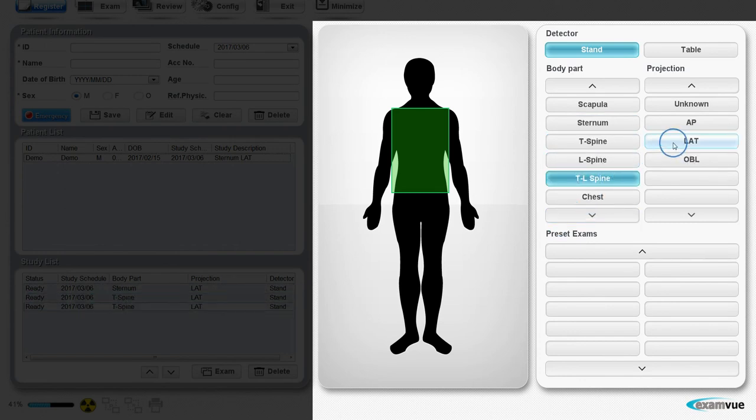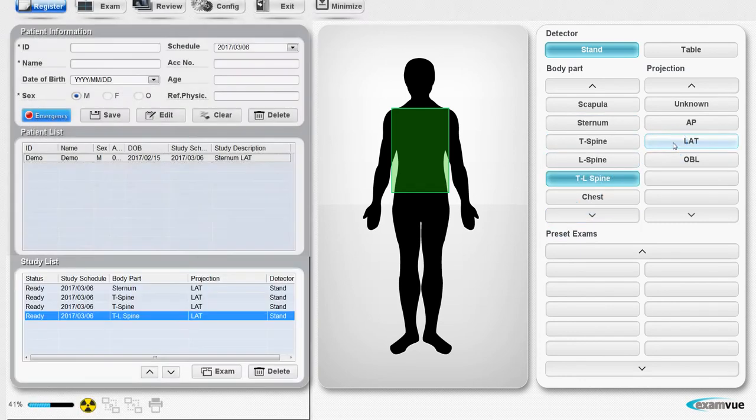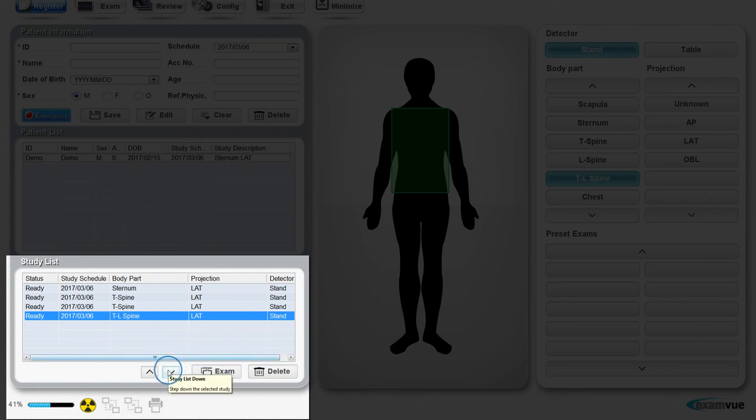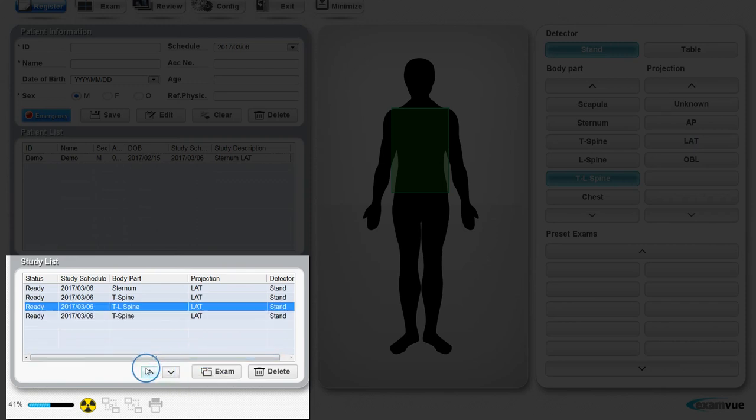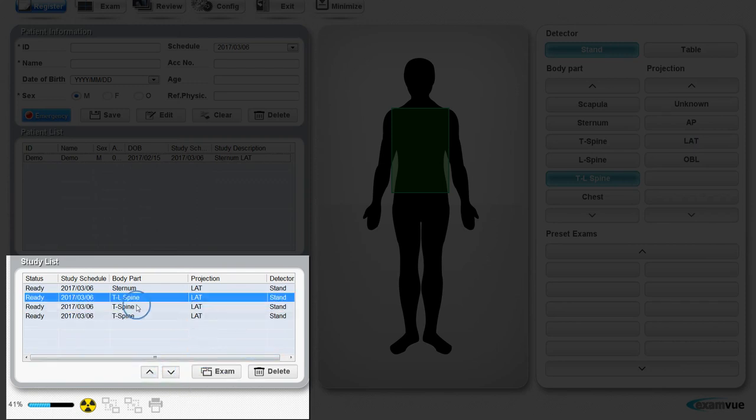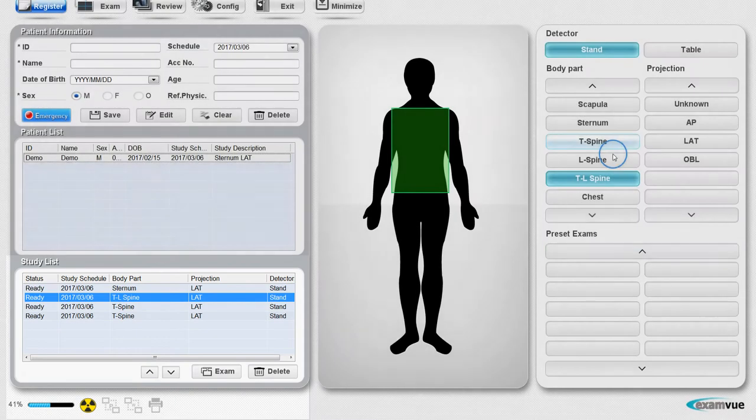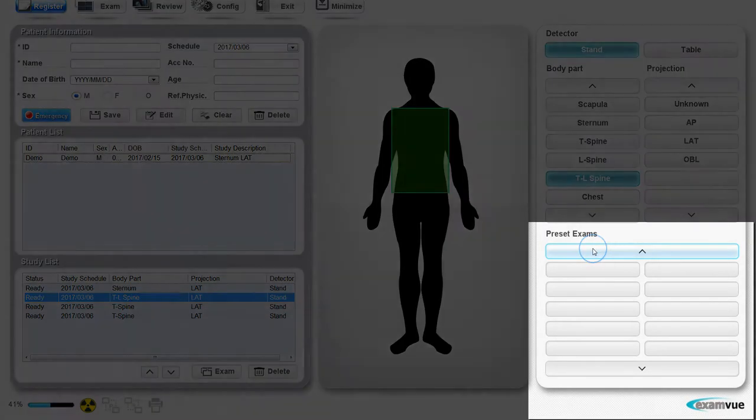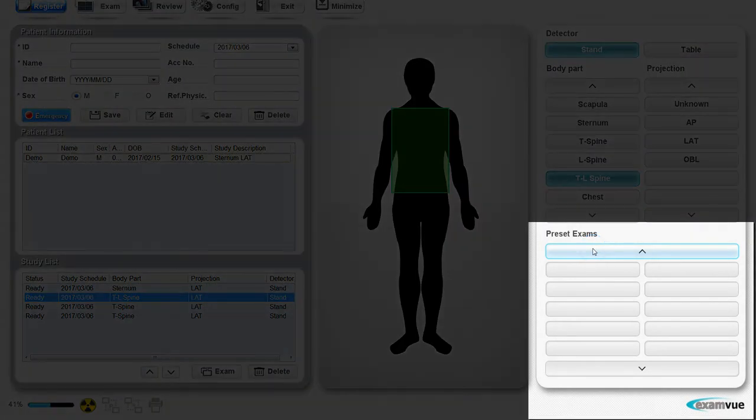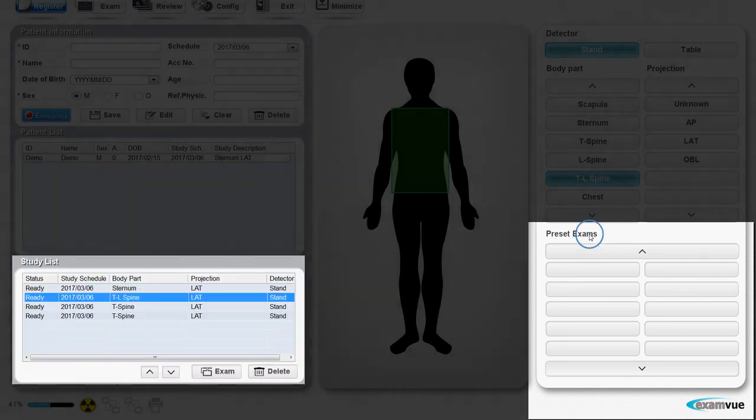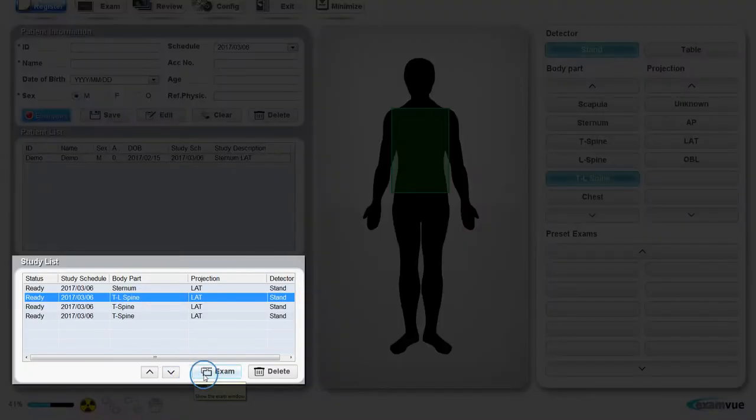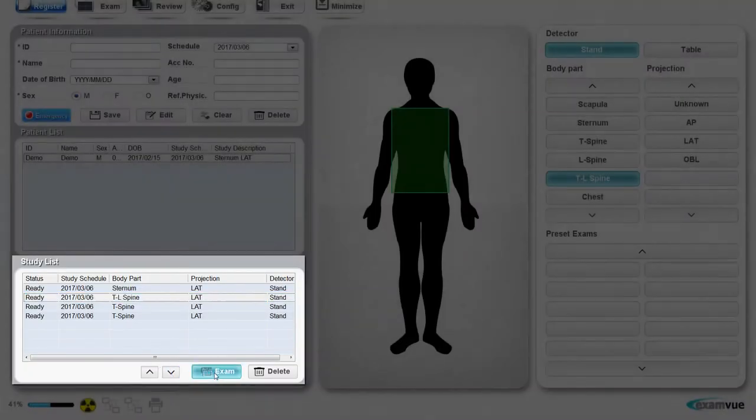You can move them or arrange them accordingly to the order you want to take them. You can also set preset exams, which will be a list of several x-rays you take together regularly, such as spinal exams or accident exams. Once everything is set, click the exam button.